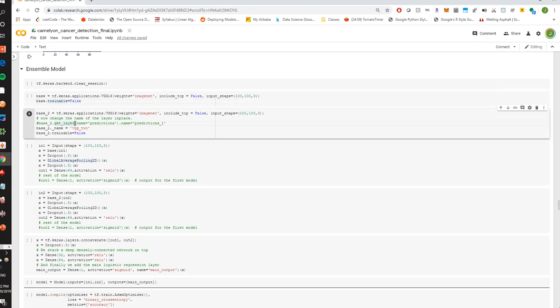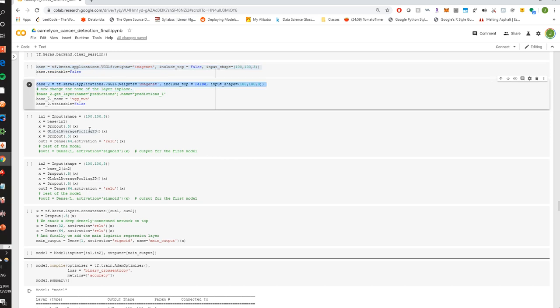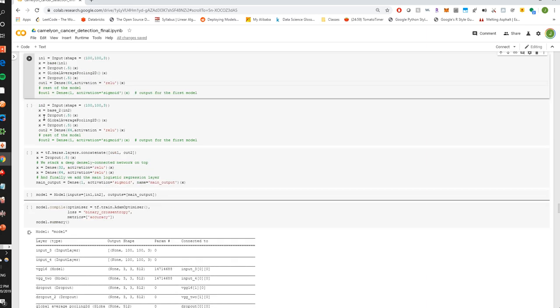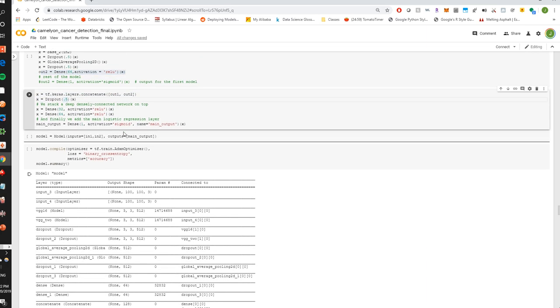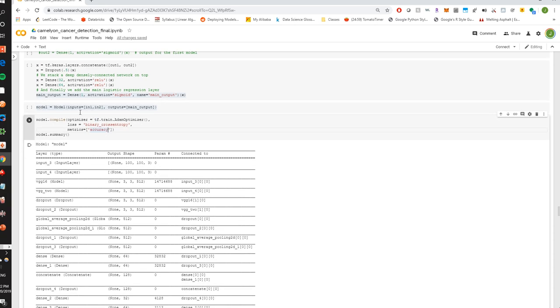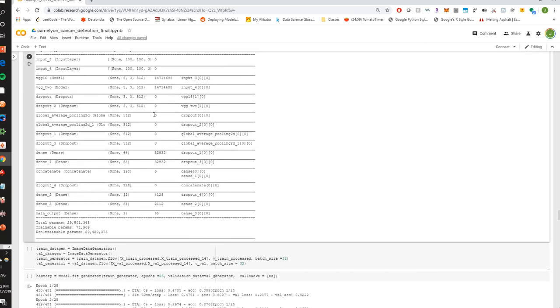So we feed that into our model using, what's it called? The functional API. We have 2 separate base architectures in parallel. Each has its own dropout layers, pooling layers, dense layers, right? Here's the output from the first architecture and the output from the second architecture. This is concatenated into one model and one prediction. Pretty straightforward. Hard to implement, but the understanding is pretty straightforward. You specify that these are 2 inputs, level 3 and level 4, and we get 1 main output. This is the architecture.